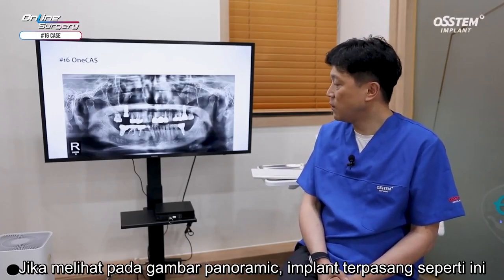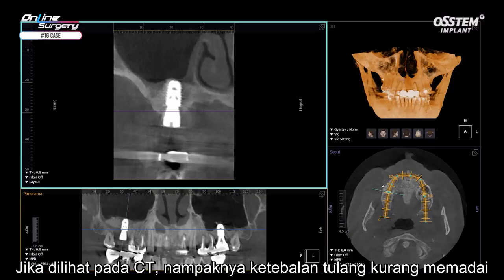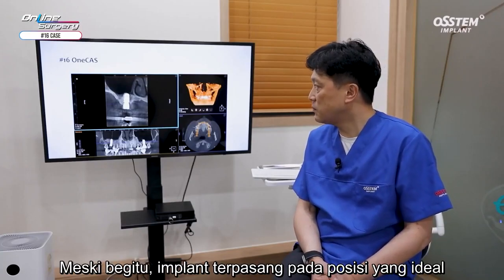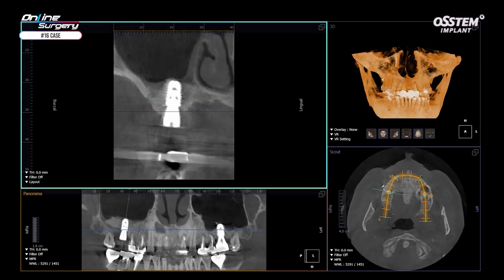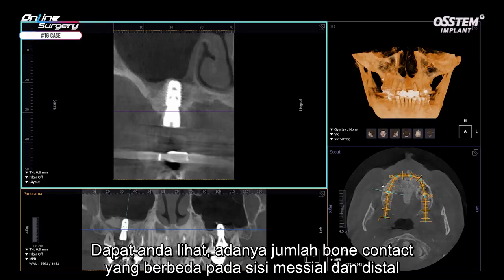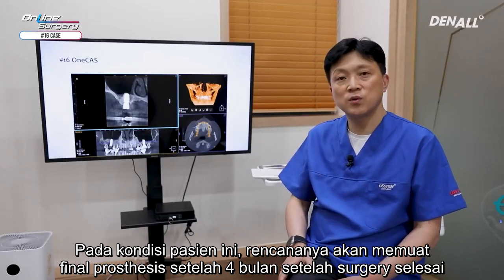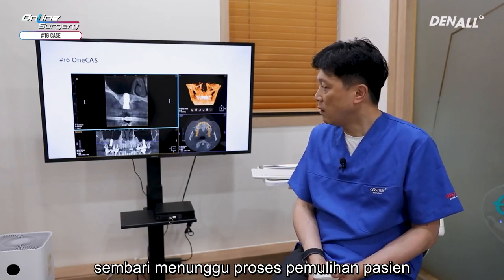If you look at the panoramic image, the implant was placed like this. On CT, in a certain sense, the level of bone regeneration was quite insufficient. However, the implant was placed in an ideal position. As you can see, the amount of bone contact on the mesial side and distal side differs significantly. In the case of this patient, the plan is to deliver the final prosthesis 4 months after surgery so as to allow sufficient healing.